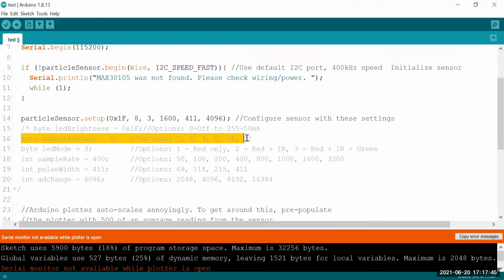Then we have the sample averages. That's how many samples it takes in rapid succession before sending a printout. That way, if just one value just happens to have some noise in it, it'll average them out. I've picked for each time it outputs one value in the plotter to be an average of 8 values.